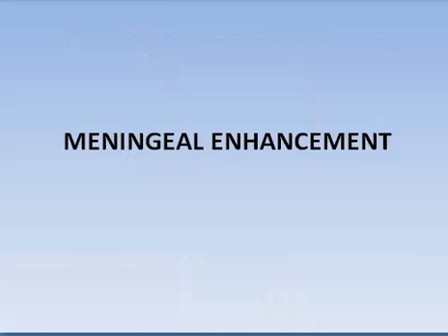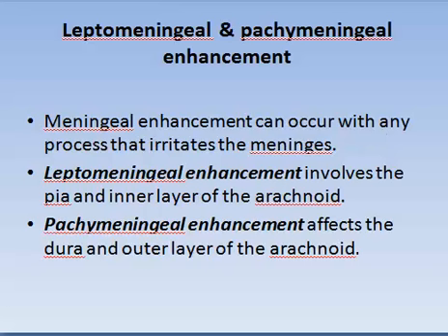Now come to meningeal enhancement. It is either leptomeningeal or pachymeningeal. Meningeal enhancement can occur with any process that irritates meninges. The leptomeningeal involves the pia and the inner layer of the arachnoid. The pachymeningeal involves the dura and outer layer of the arachnoid.